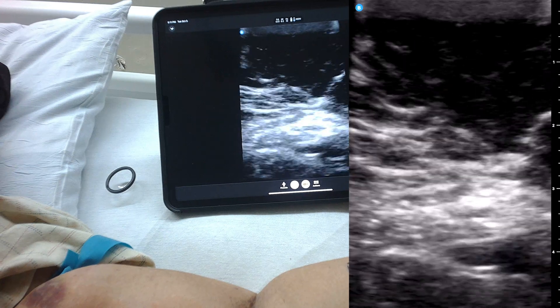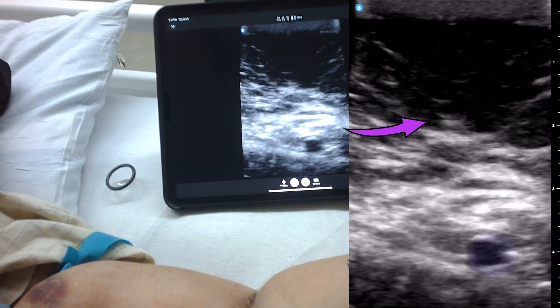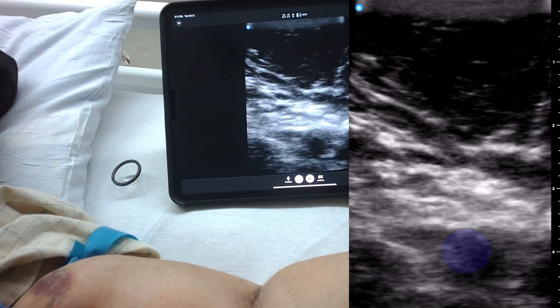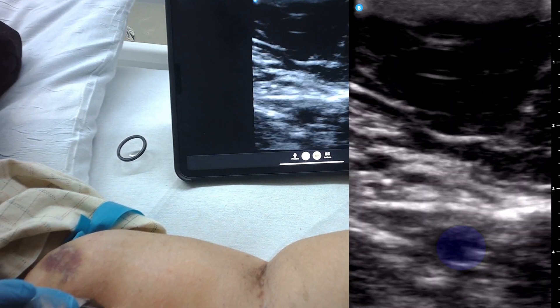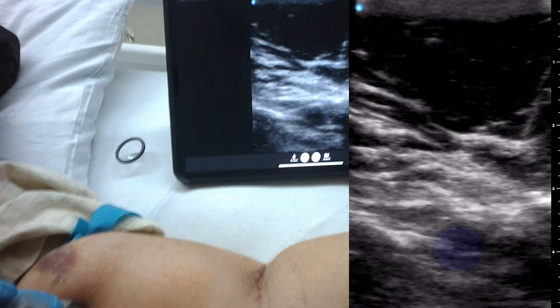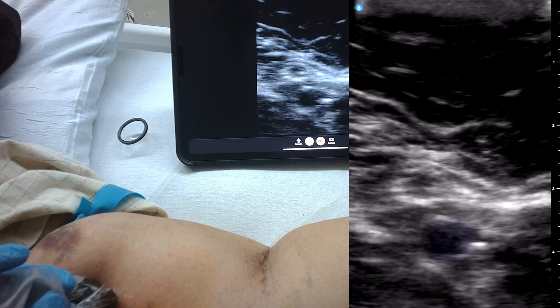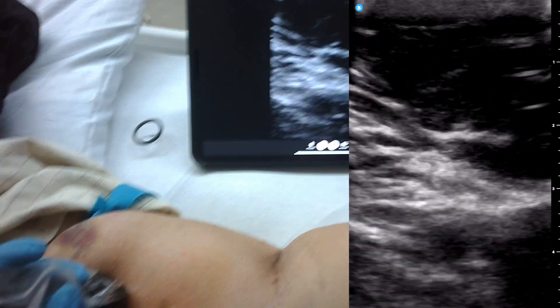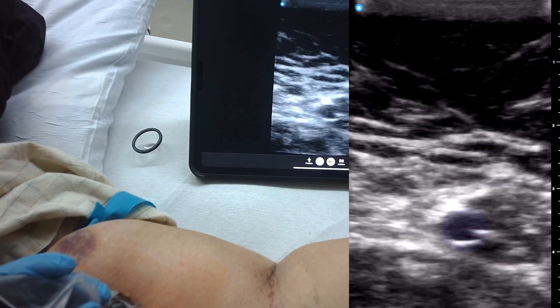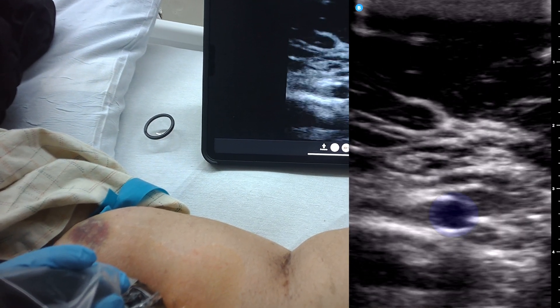Can you feel that? No, I don't feel it. Now we're about to hit fascia, so we'll see what happens. That's pretty deep — I'm going to have to go at a much steeper angle. I know it's weird to have that needle in you.